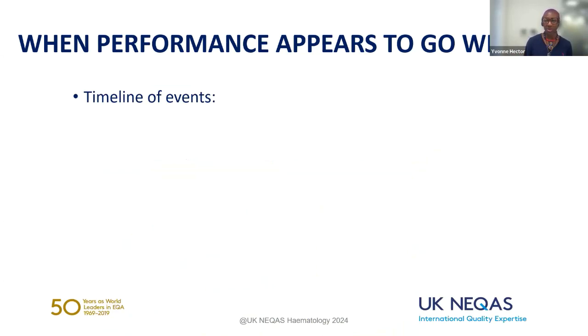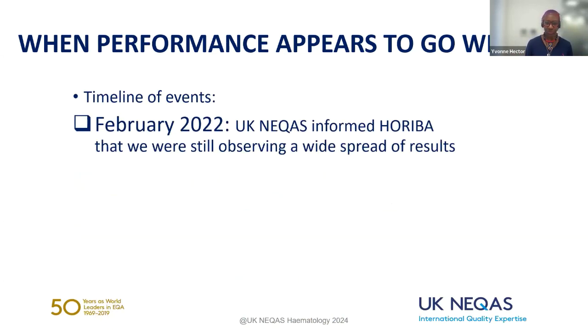Then in February 2022, I emailed Horiba to inform them that we were still observing this wide spread of results. As I said, logically, if everyone's doing the same thing, we should expect everyone to obtain the same result, and we could not explain why we were continuing to see this difference when we were making sure everyone was doing the same thing.